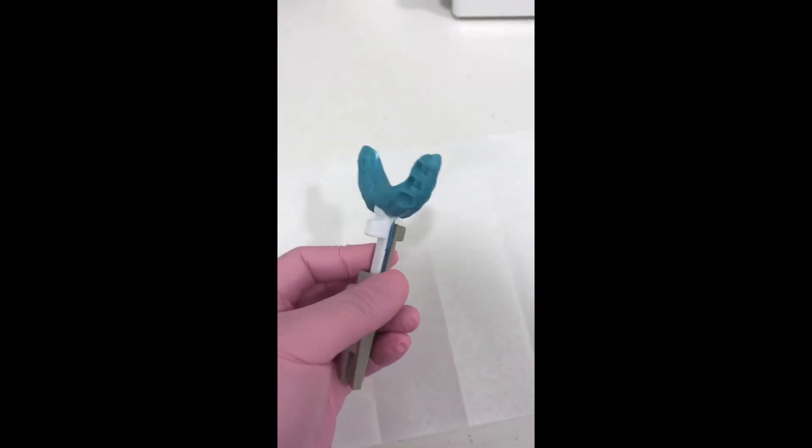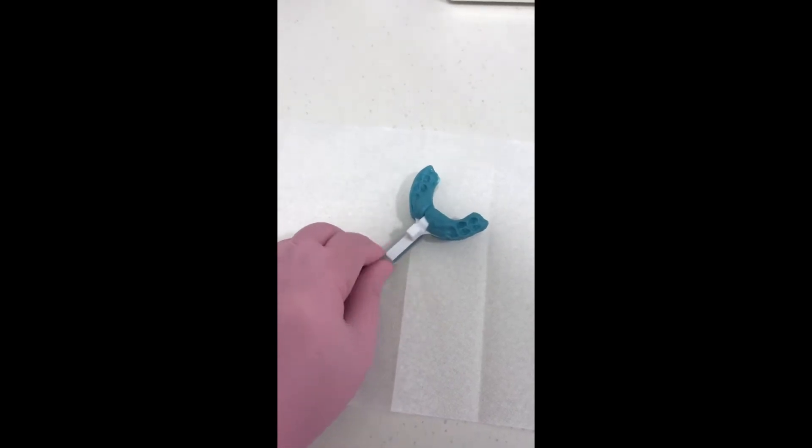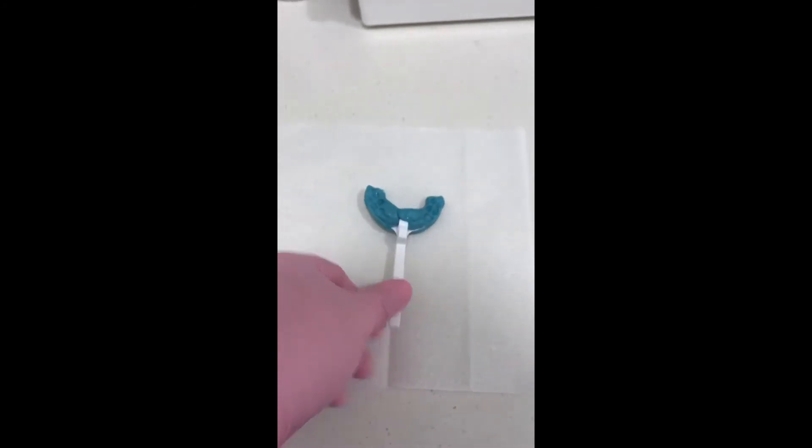When the putty has set, you can loosen the upper turn screw. The bite fork with the putty will be sent off to the lab together with the impressions. The George gauge can be sterilized ready for the next patient.